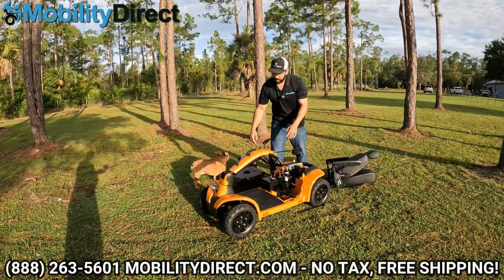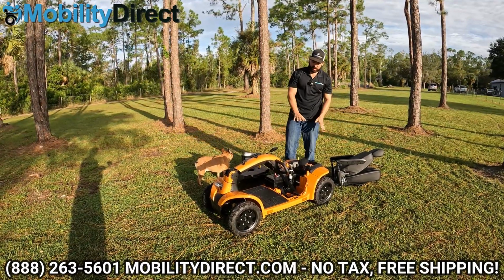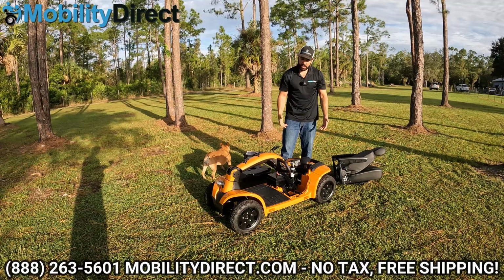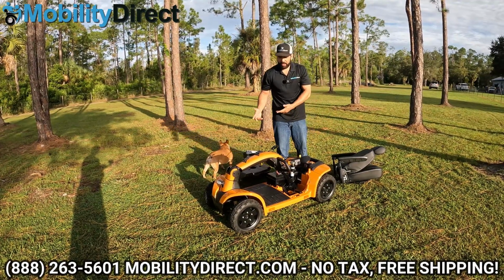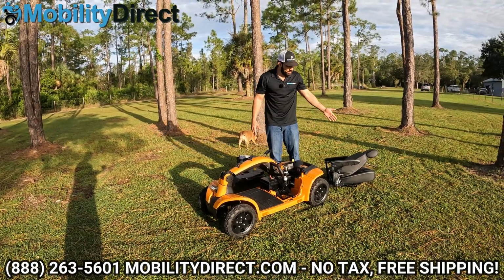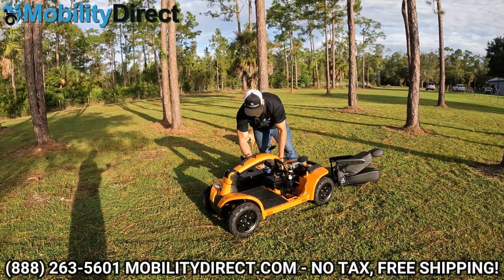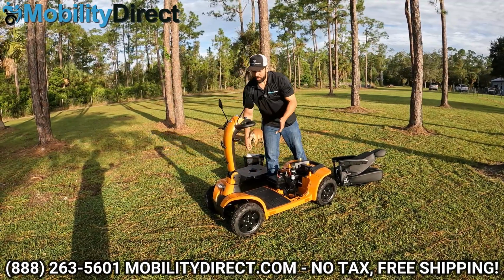So by lowering the handlebar assembly all the way, you can see that it takes a pretty low profile, and you might be able to get it into the back of your SUV or your van that way. You would need to put the seat somewhere else. You could obviously throw the battery cover back on there before putting it into your van or SUV, but that's a common topic.